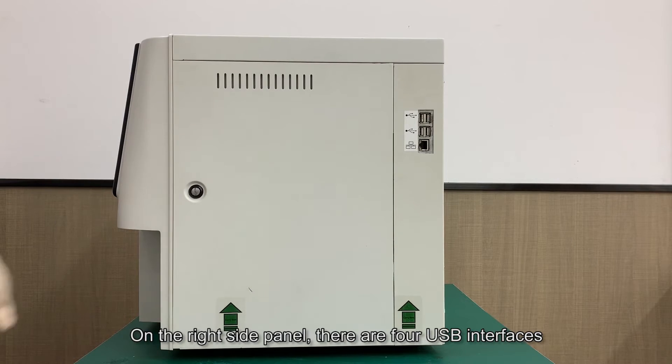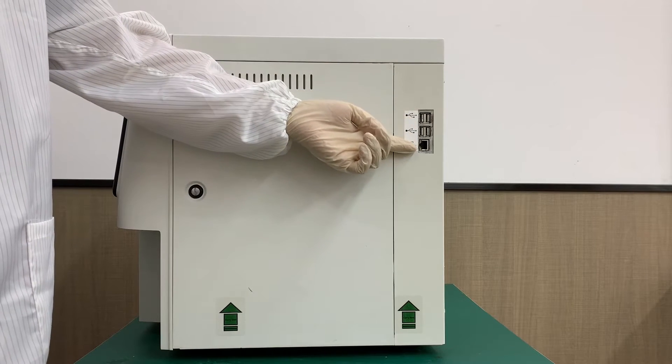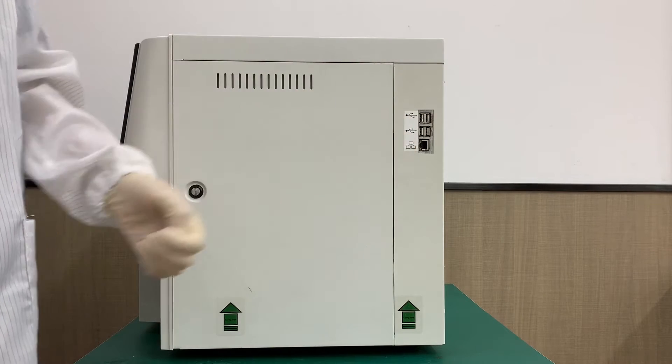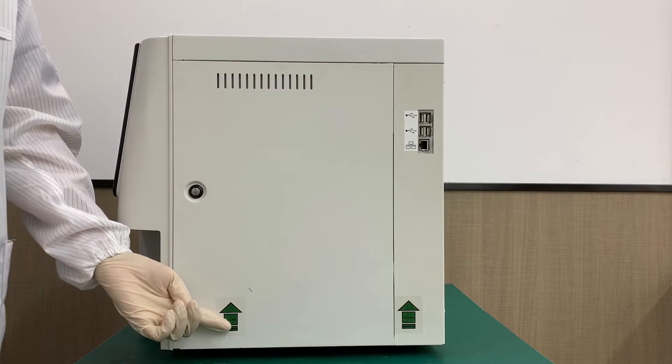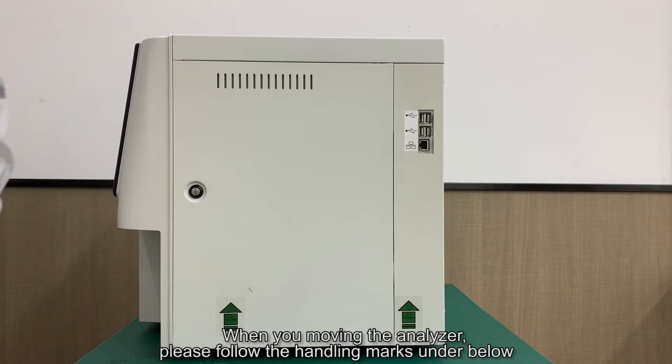On the right side panel, there are four USB interfaces and this is the LAN port. When moving the analyzer, please follow the handling marks shown below.